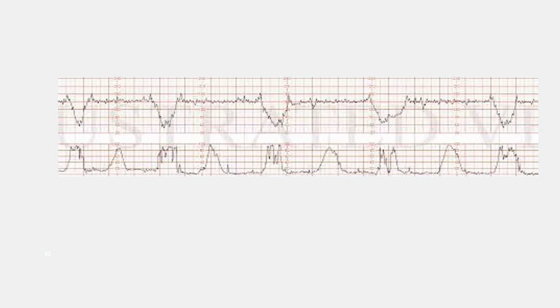If you see those little spikes, those are pushing marks, okay? So when the patient's pushing, they'll look kind of square-shaped. And you'll see these 3 spikes because they're pushing. And because of these decels, they're having her push every other contraction.